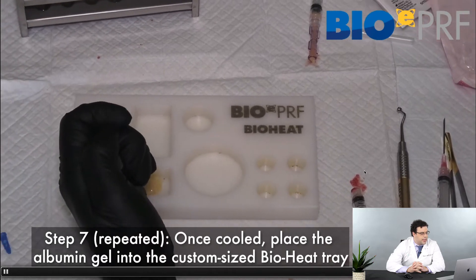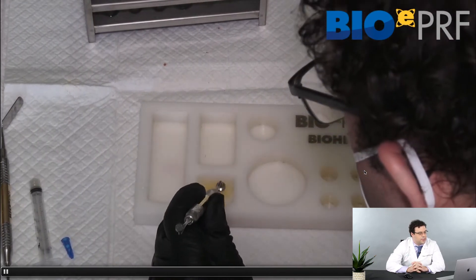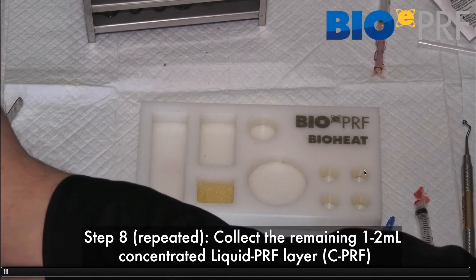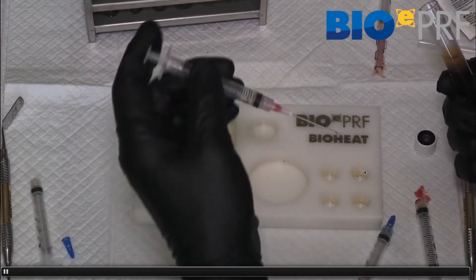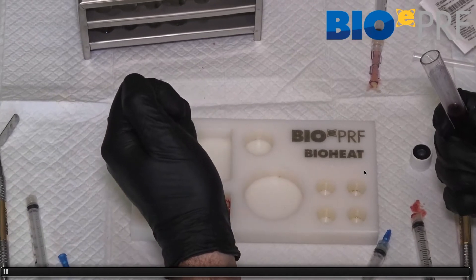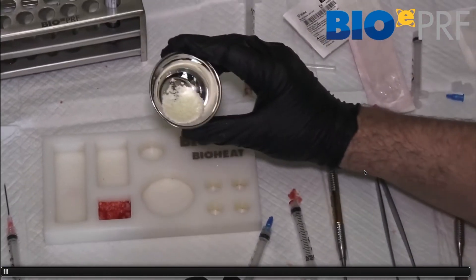First step is to apply the albumin gel — showing double videos from two different angles to educate doctors. The albumin gel is placed and then compacted. Next, we add the liquid platelet-rich fibrin — the CPRF layer. Pop the lids because we want it to clot. Grab the 18 gauge needle, go right to the buffy coat zone, and draw out the liquid CPRF, then apply it. At this point we've made our EPRF membrane — if you only wanted an EPRF membrane, you'd stop here and let it clot for 15 minutes.